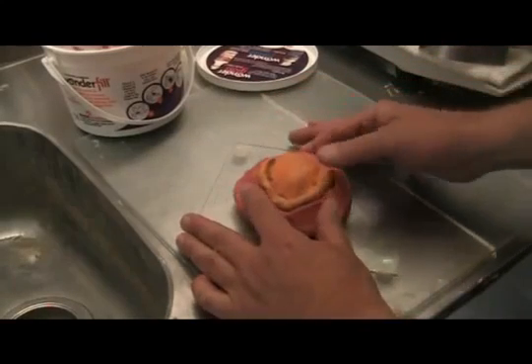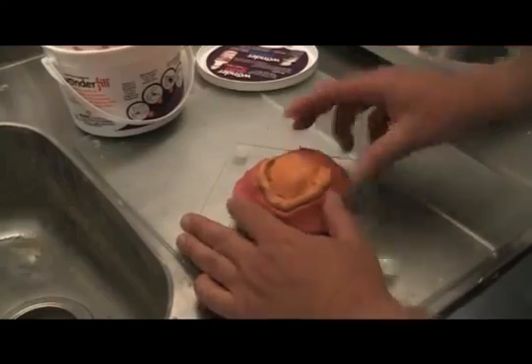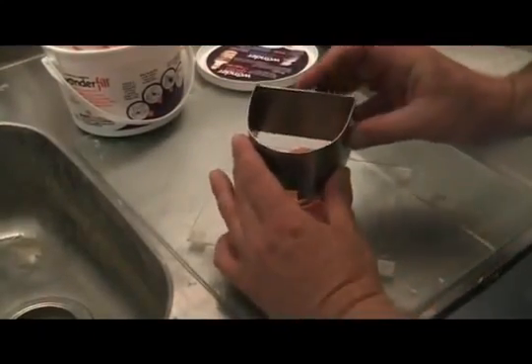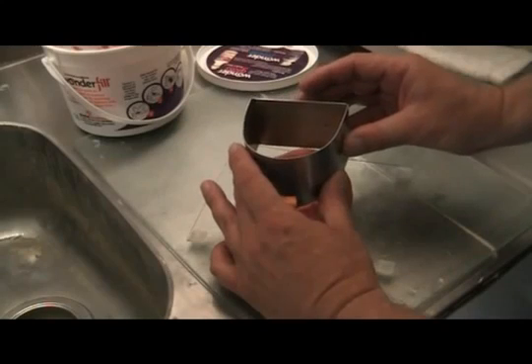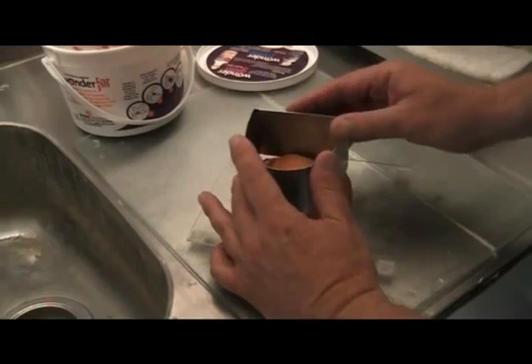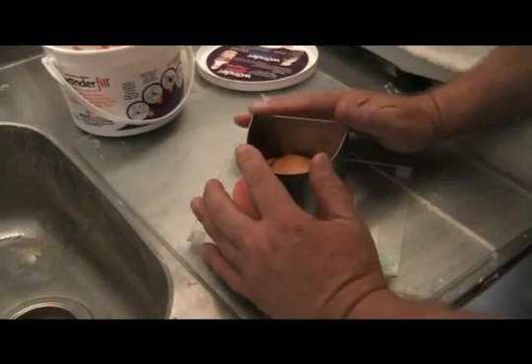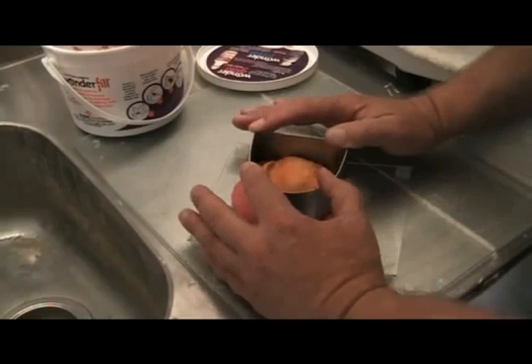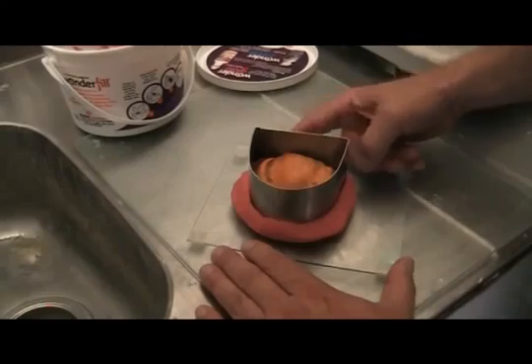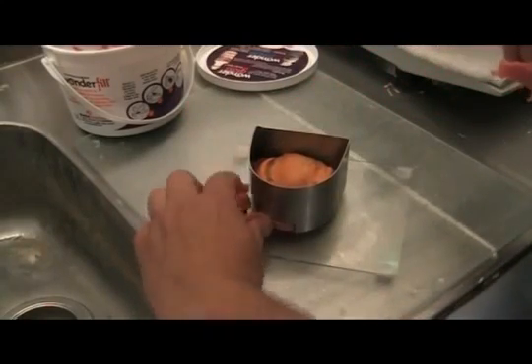Okay, once I get it surrounded, as I do here, I'll grab my Wonderformer and I'll place it on top. Try to center it so that I have an adequate amount of Wonderfill material all the way around, which is going to basically create a land area for the impression when it's boxed. And then once I get it in place, I press it down.